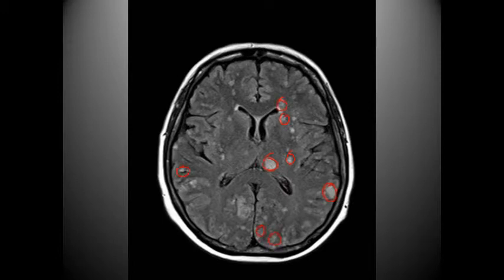These areas that I've circled primarily are demarcation for brain metastasis. As you can see, they're kind of all over the place, and obviously it wouldn't be uncommon to find brain mets among patients who have a known primary.